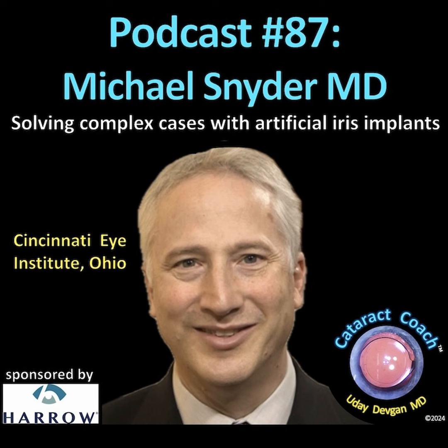Okay. And invariably in every 100th or 150th image, we'll have one of these old PMMA IOLs that has a hole in the IOL. And we take a picture of the hole in the IOL and we throw it up to the residents. What's going on here? It's like, something's wrong with that IOL. Did they have a laser treatment that went awry? They don't even know that IOLs had holes in them because you just don't see them that much anymore. But they still crop up from time to time and they're super interesting.